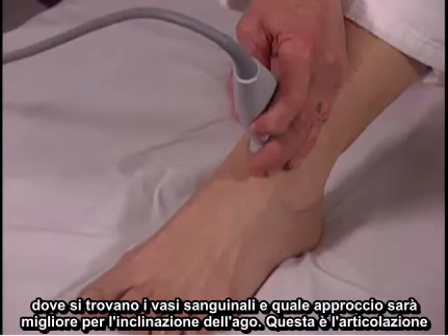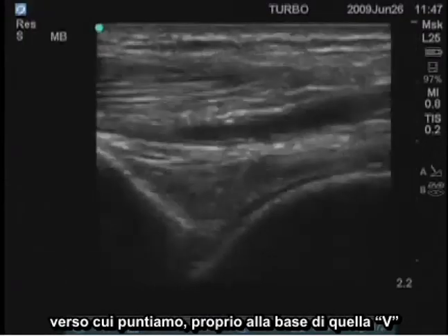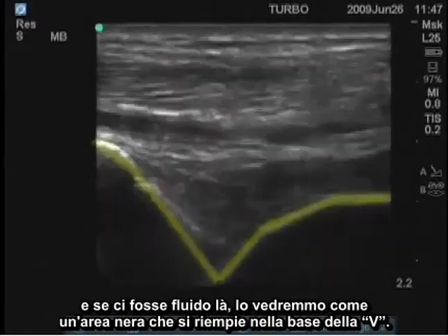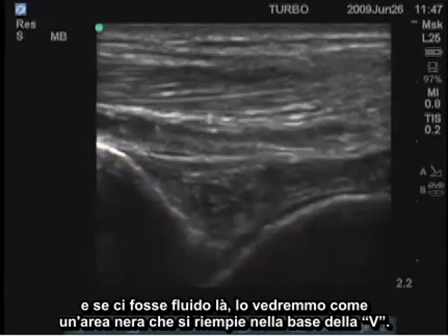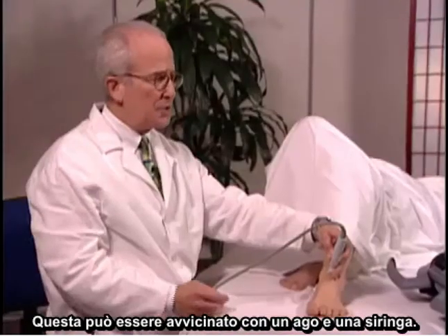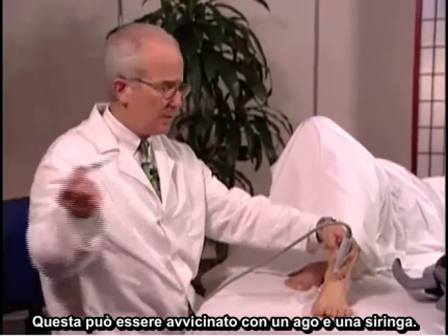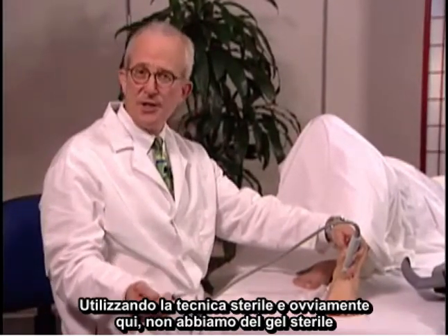This is the joint that we would be aiming for, right at the base of that V. And if there were fluid there, we'd see it as a black area filling in the base of the V. This can be approached with a needle and syringe using sterile technique.